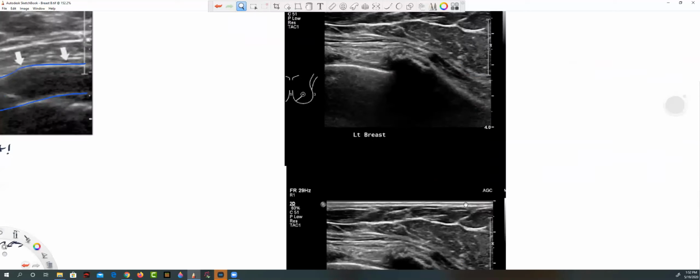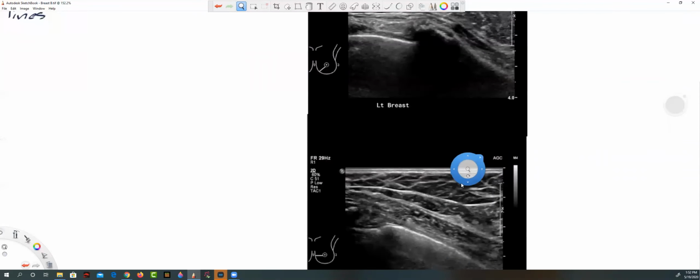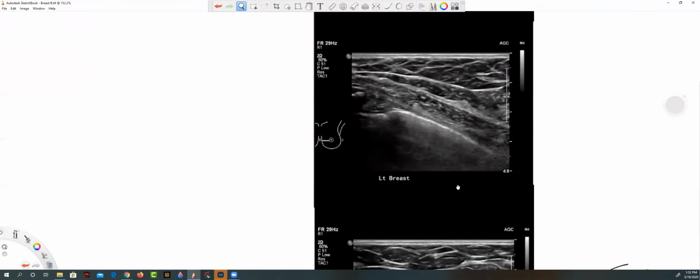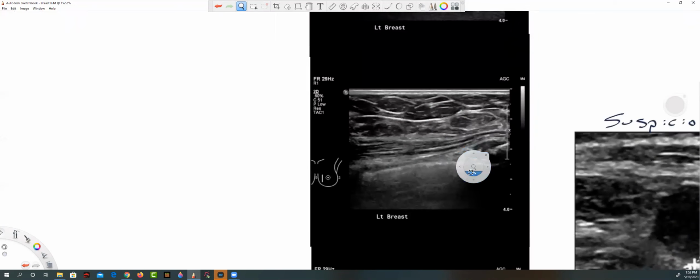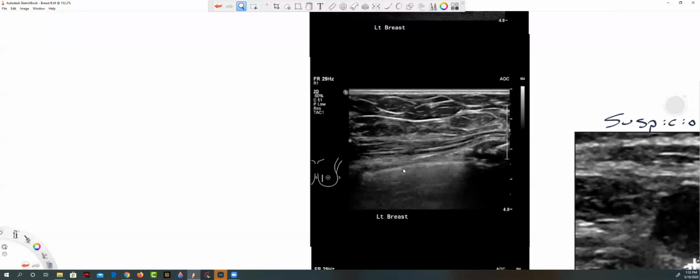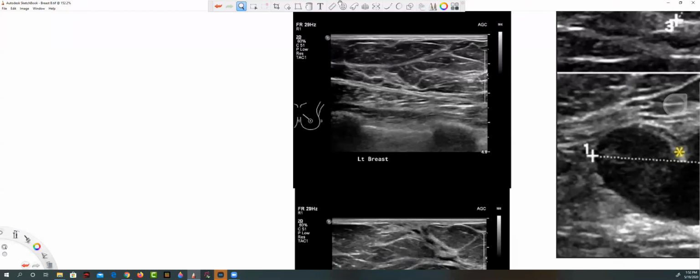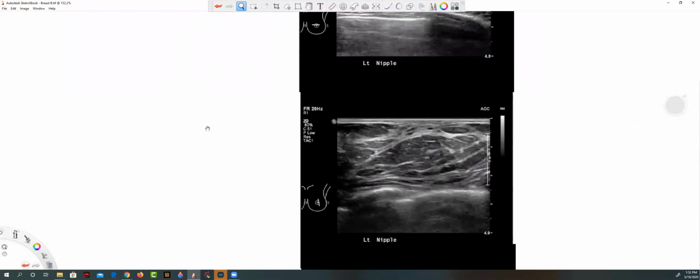So they're really on the edge. Over there at the 8 o'clock position, 9 o'clock position, still just, it's easier with my mouse. Fat, fat, fat, fat.